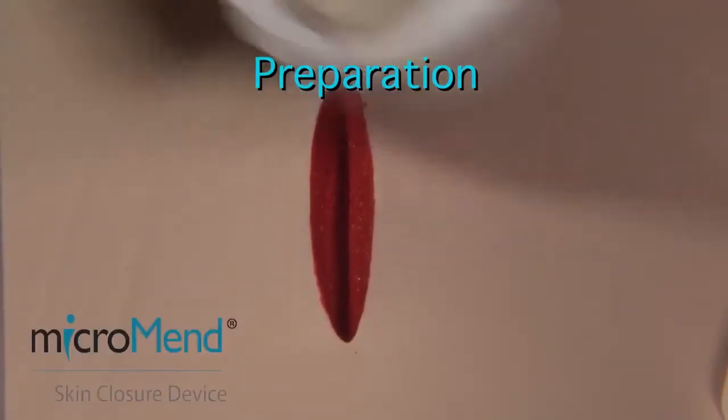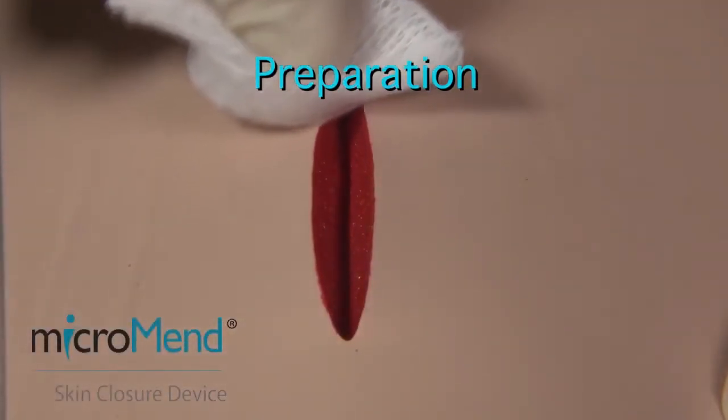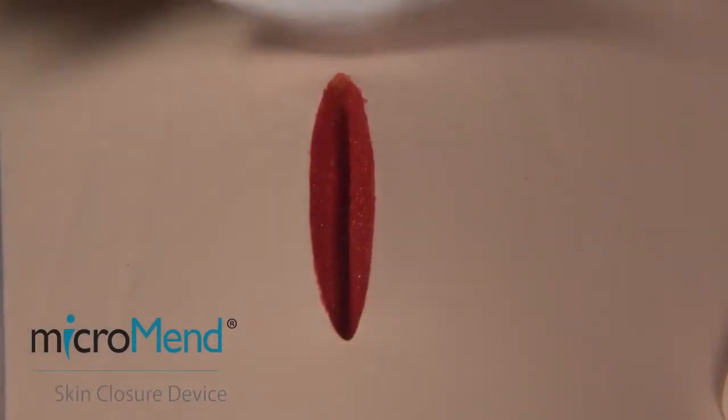Before and during the application of Micromend, it is important that the wound area be completely dry and free of blood and exudate.